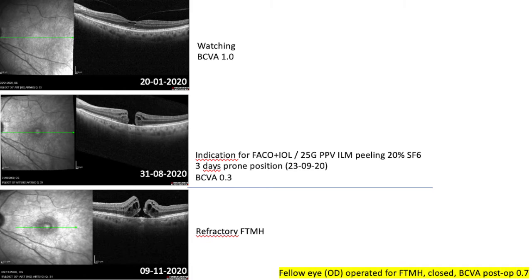Later on in August he developed a full thickness macular hole that was operated with combined surgery — cataract and 25-gauge vitrectomy, ILM peeling — and was tamponated with SF6 20%, three days prone position. But still the macular hole was open, and a few months later was operated for refractory full thickness macular hole. The fellow eye, right eye, was operated a few months before and the full thickness macular hole was closed with a visual acuity of 0.7.